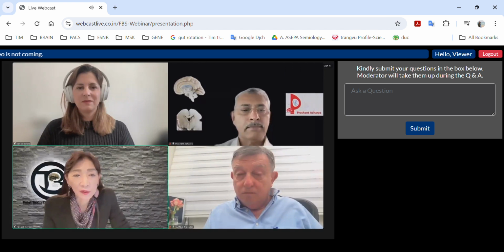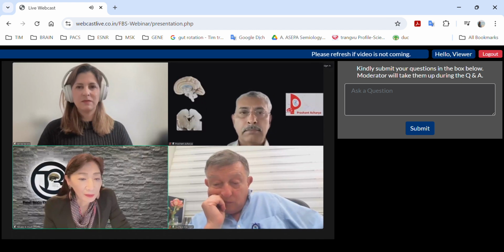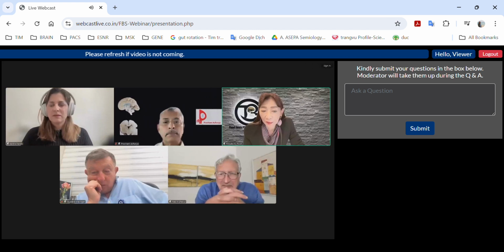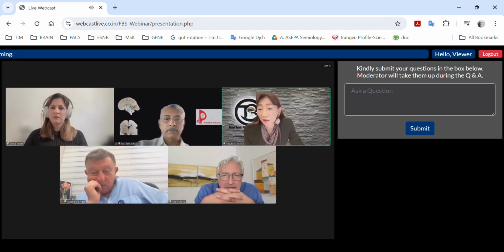And we have several questions from the audience, and I'll try to select some of them. And the first of all, which is better, the more specific measurement of the small head, BPD, HC, or transcerebellar diameter? Is it the HC, right, Gustavo?